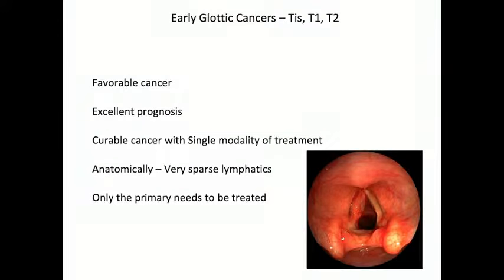This patient needed 3 laser procedures at different intervals. And finally, now the patient is disease-free and eating. This is one of the rare things where we used our experience with laser to make the patient decannulate for a laryngeal edema. The real application of transoral laser surgery is in early glottic cancer.